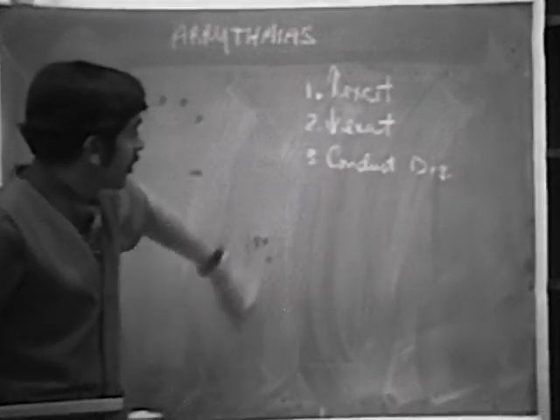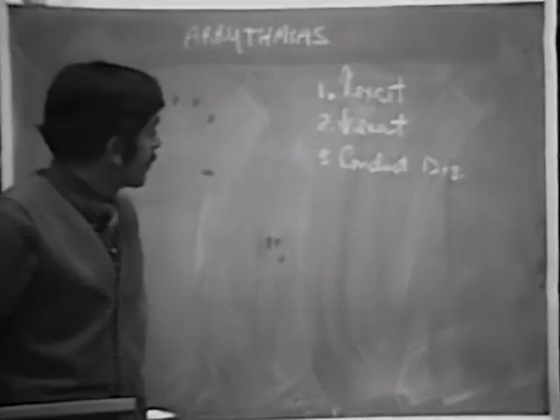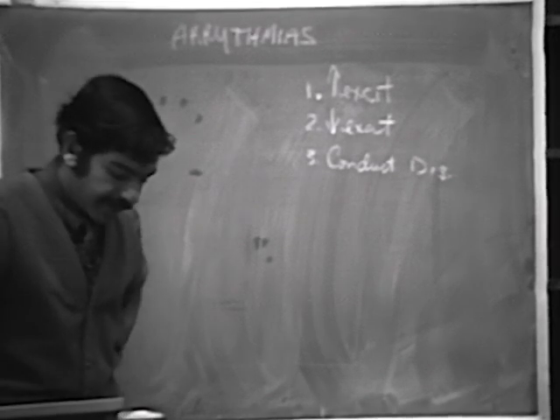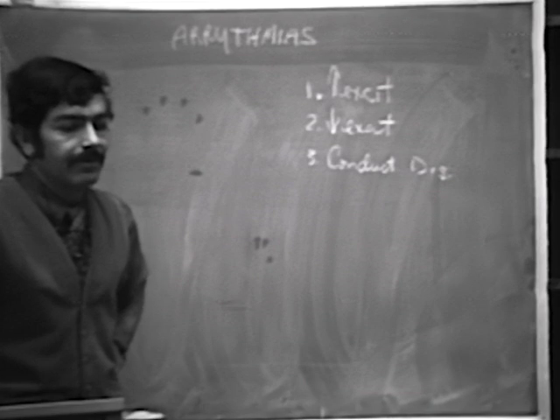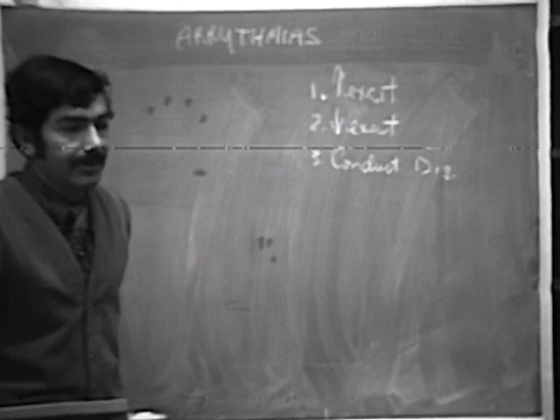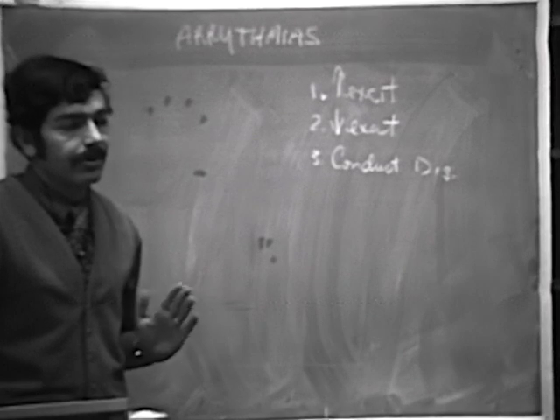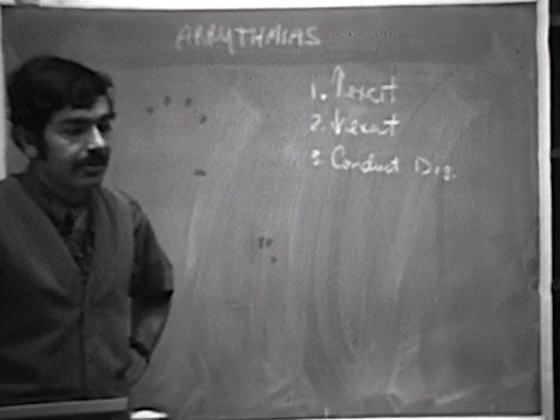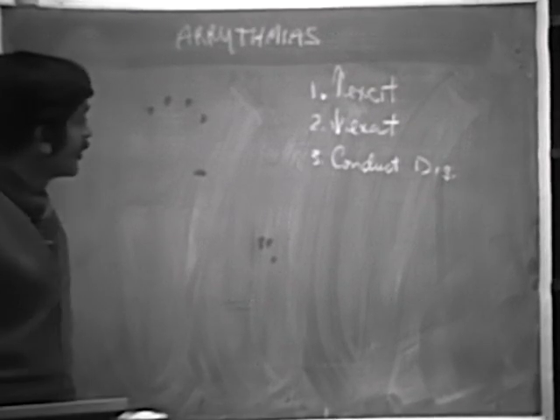Sometimes they can be combined. And if you just keep this basic outline in mind, it'll sometimes help you understand a lot about arrhythmias as well. Another thing that's very helpful, I've found with arrhythmias, is to get yourself a pair of calipers. They're not very expensive. I don't think they cost between $5 and $10. And they can make all the difference in the world in terms of an arrhythmia being fun and interesting or just being very difficult and a threat to you.